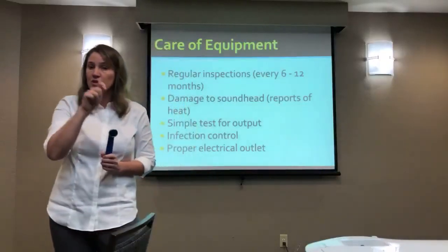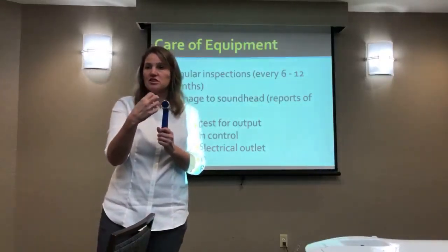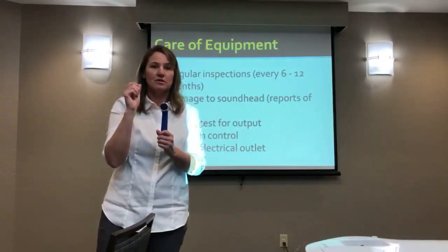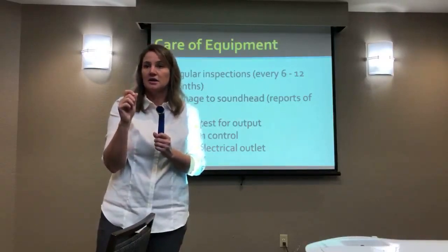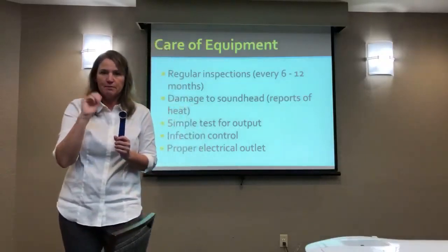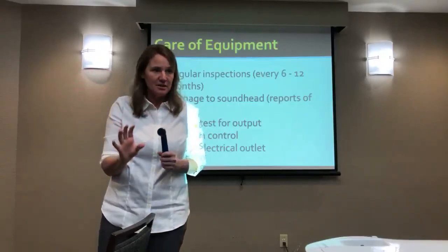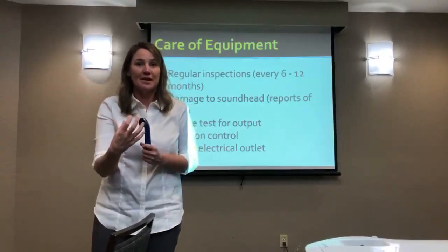If you're doing a treatment and there is air getting in, that crystal can start to heat up and the machine will beep at you and tell you you're not in good contact. And you're supposed to correct that. So the blue and white ones will beep, beep, and eventually shut off, because it's saying you're not listening to me, so I'm just going to shut off before you break me.